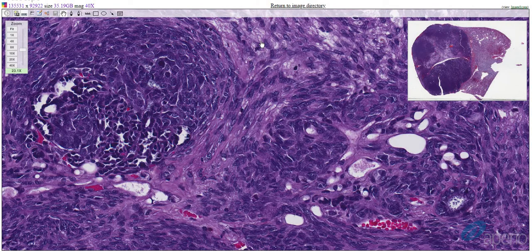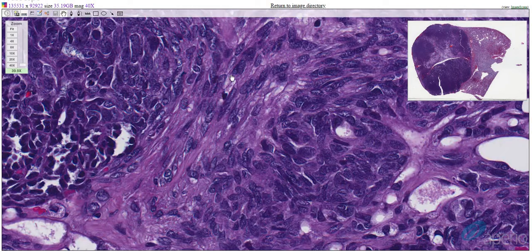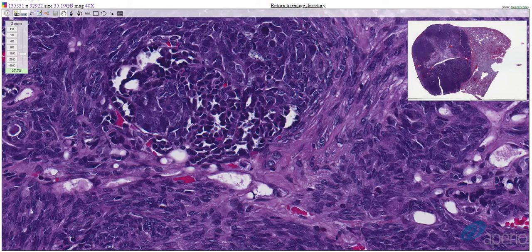Mesenchymal cells, on the other hand, are composed of neoplastic cells arranged in streams and bundles. They have indistinct cell borders that contain fibrillar eosinophilic cytoplasm. The nuclei are generally elongated with finely stippled chromatin and indistinct nucleoli.